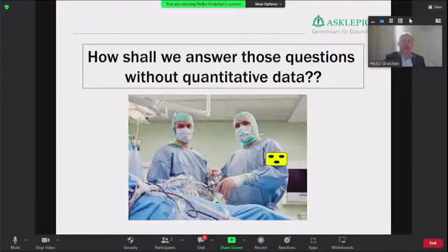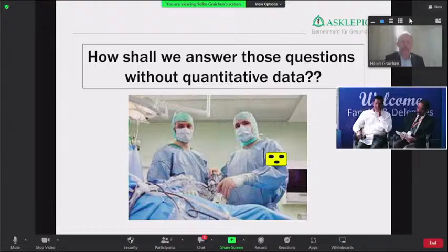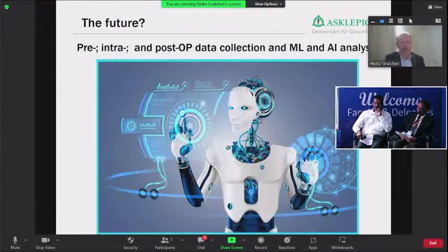And that is probably the greatest benefit of all these digital tools. You really have quantitative data. So that's the big difference compared to conventional surgery, where everything relies on the experience of the surgeon and the impression that he has on that knee. So there is more qualitative data, but with the new digital tools you have quantitative data, and that quantitative data then can be used for further analysis. So that is, I think, the future, that you connect all the different data that we have.